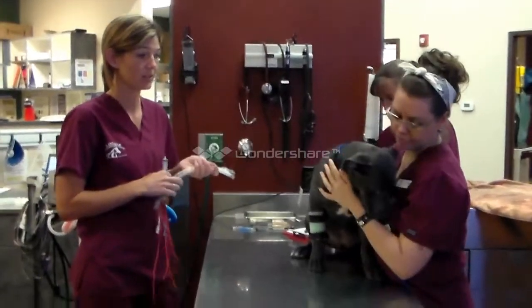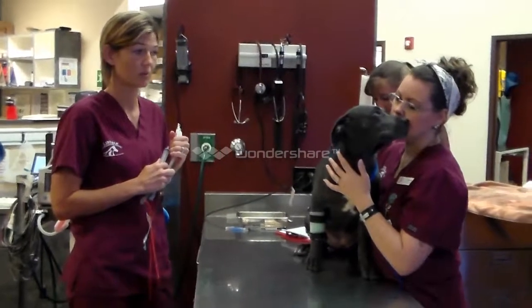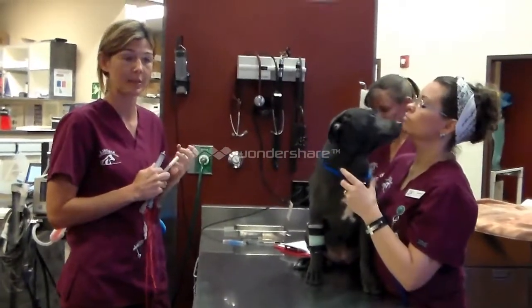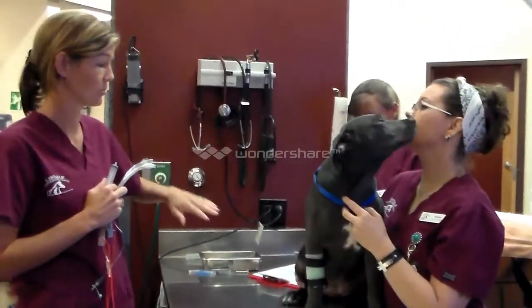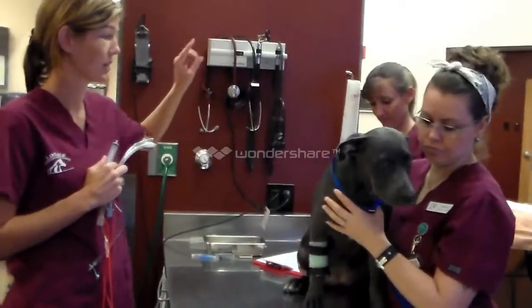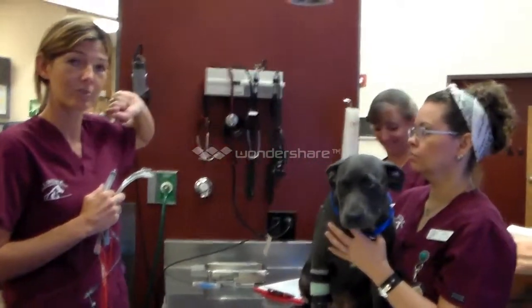This is Mandy. We're getting ready to induce anesthesia. We'll prep her and take her in. She's being spayed today. So we've made sure that she is, of course, the correct patient. We've verified the procedure that she's here for. This is Dr. Smith over here for our direct supervision.